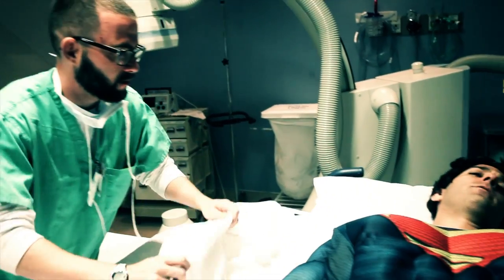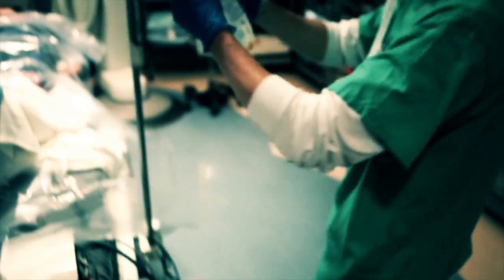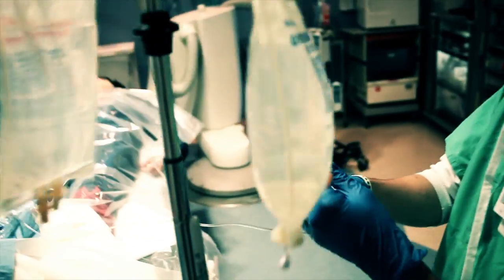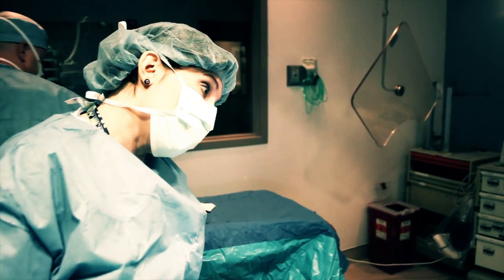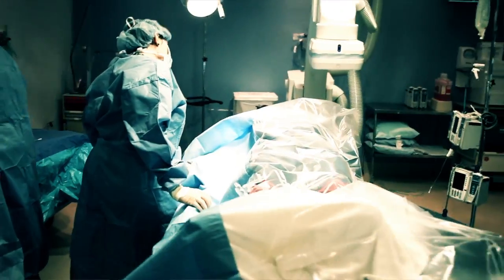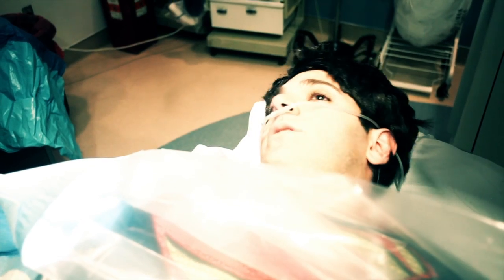We're going to get you moved over onto this bed here, sir. I feel pain in my heart. We're going to fix it soon. Hi, Mr. Kan, I'm Dr. Zayad. I'm going to be doing your procedure today. I just wanted to talk to you about how we gain access to your arteries. We have several different approaches, and for someone like you who is extremely active, we are going to choose a wrist approach or a radial approach. You'll be able to get up and about much sooner than you would if we had gone through your leg, which is the traditional approach. That sounds great.